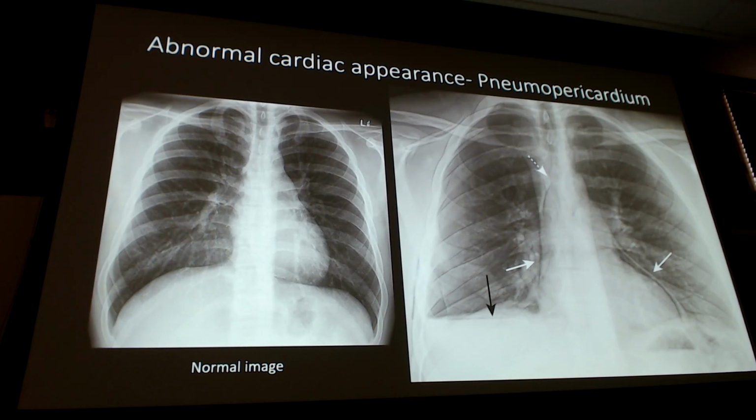Can it cause a tamponade? Sure, it can, depending on how much air, how much pressure, what's going on, right? Is it something to where it's frequent enough to be worried about it for us from just the air standpoint? Not really, because look at how small the amount of air is. That's not a whole lot of pressure. I'd be more worried about if this pneumothorax turns into a tension pneumothorax than I would be about the air in the mediastinum or the pericardium causing a tamponade.